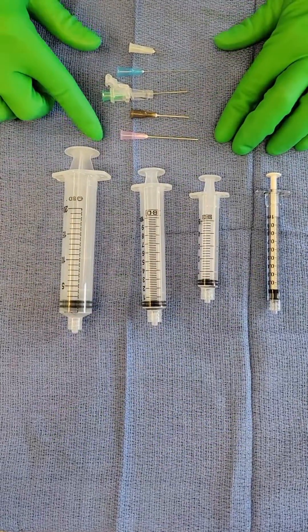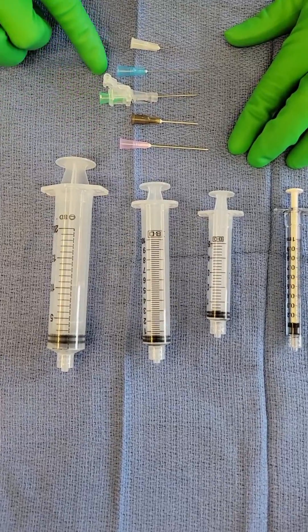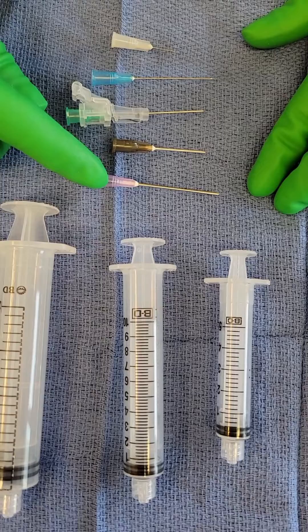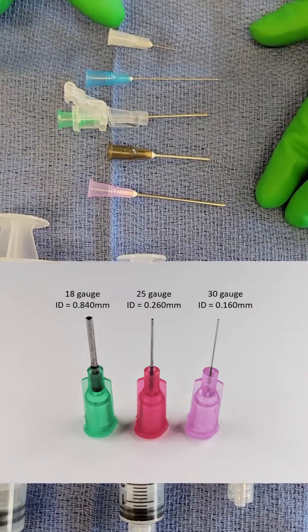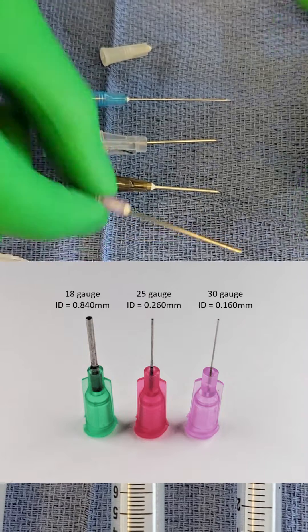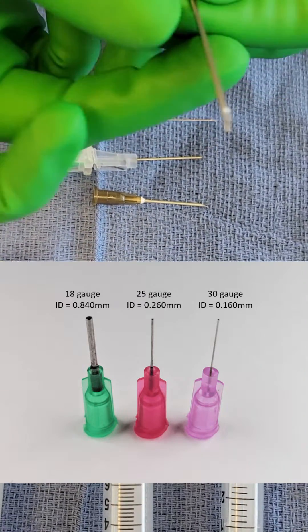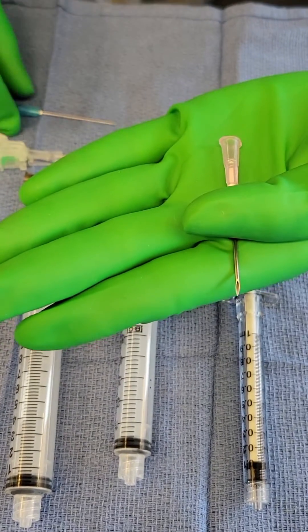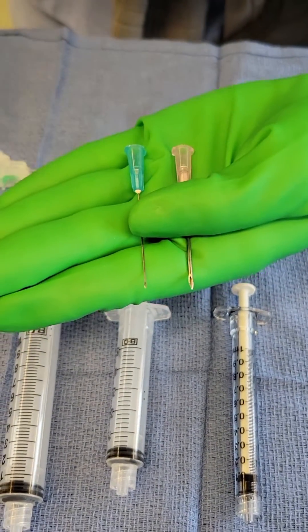We wanted to compare and contrast that hypos come in different sizes, as you can see here. This is an example of an 18 gauge hypo, whereas this is an example of a 30 gauge hypo. When we say gauge, we're talking about the diameter of the needle itself. This here is an 18 gauge needle, whereas this is a 25 gauge needle.